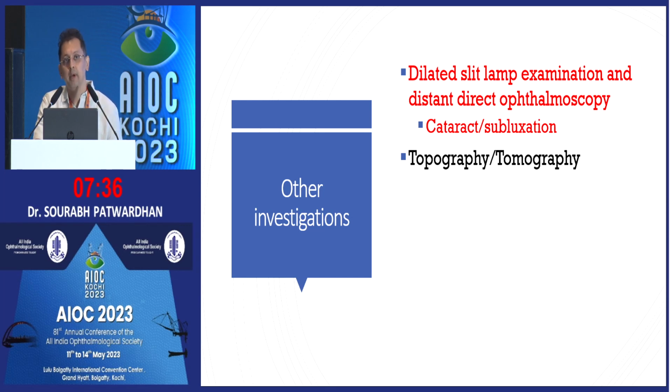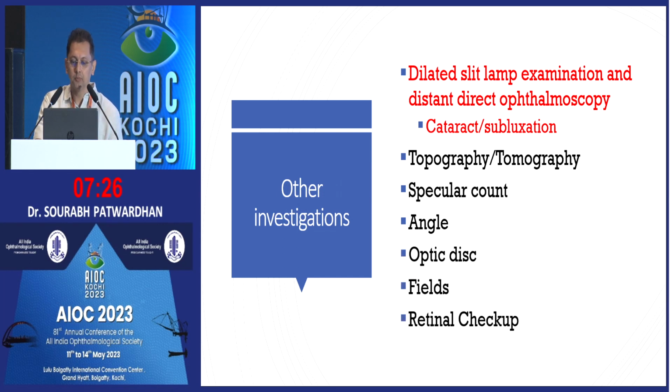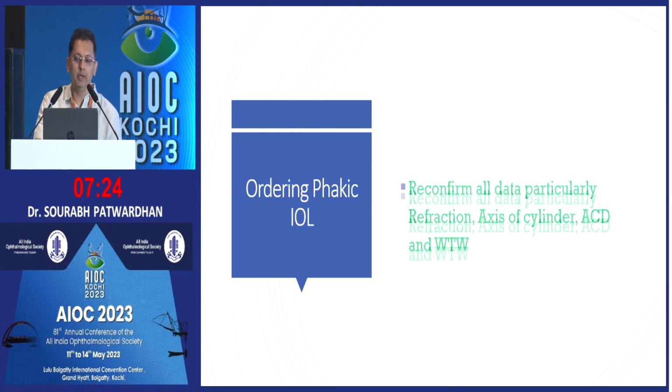In some high myopes, there might be mild subluxation, so make sure that you examine these patients properly after full dilatation yourself, so as not to miss this kind of patients. Other tests preoperatively are very important.